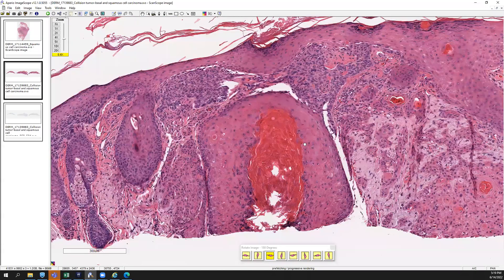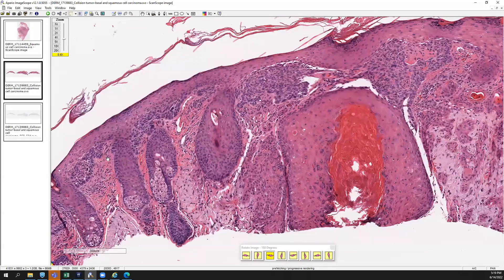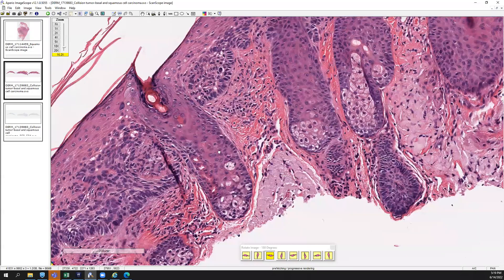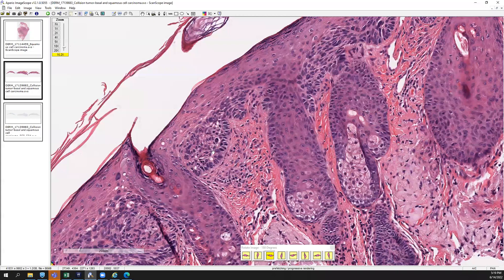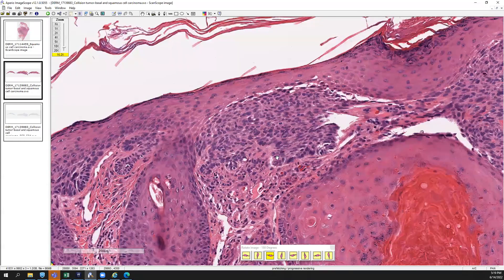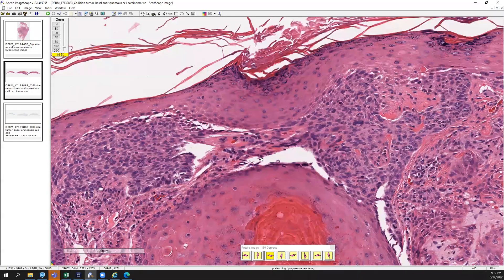Over here, interestingly, at the top of the epidermis, you see a basaloid proliferation. You can appreciate this peripheral palisading of a basaloid architecture. The cells also display atypia and pleomorphism as well. You'll find some areas where it's retracting between the tumor island and the stroma. So this looks like a basal cell carcinoma here.